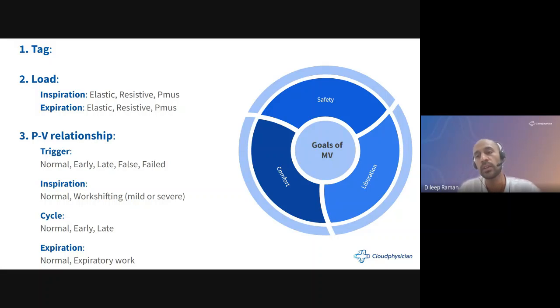The only reason to give such a high value in some ventilators is that the engineers may think that sometimes you really want to suppress false trigger. And if you want to suppress false trigger, you give a really high bar, like 10 or even 15, which frankly you should be questioning, because that means, why is the patient having a false trigger? Why is the patient struggling so much to get that breath? That must go through the clinician's mind.